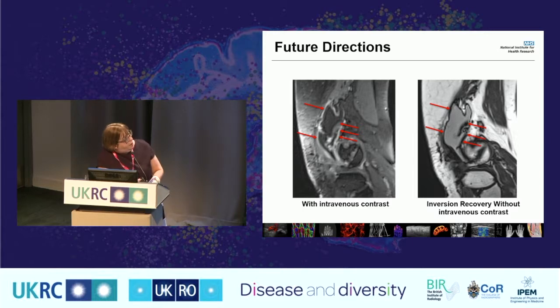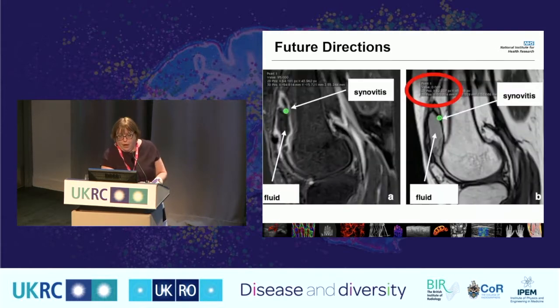So what we have here is the post-contrast MRI again. It's quite a lateral image. We've got the fibular heads coming in here. We've got synovial fluid, and we've got the usual synovitis happening here, or this inflammatory process. But now, instead of having the bright or the coloured signal, we've got this dark line. We've got this line of no signal, which for those of you who are MR people is cortical bone or tendons. We don't get signal from it whatsoever. And I can prove that this value actually comes out as 0.